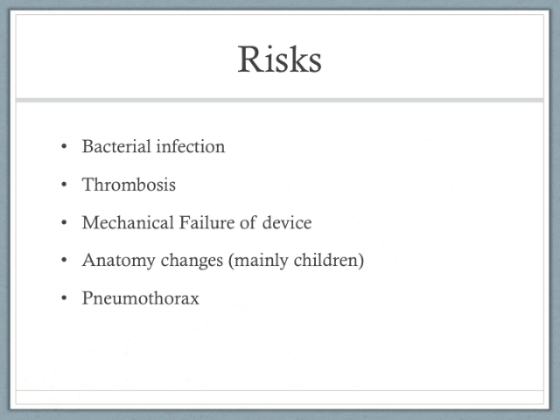And probably one of the concerns that I think most people think of is pneumothorax. This can be a result of inserting the device or accessing the device because you really are sticking a needle into the patient's chest. But it's not really a concern if it's done properly. As with any medical procedure that we do, you should use caution.